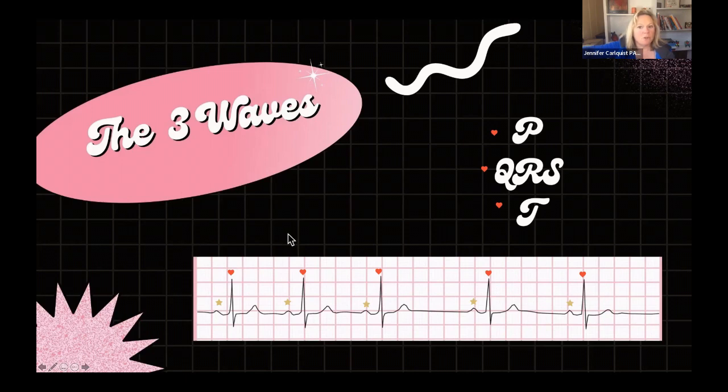So if we're troubleshooting this, then tell me if the rhythm is regular or irregular. Now, these little hearts kind of make it a little easier to see. Is it regular or irregular? The terminology means, does the R wave come at the next expected interval? So here's a little cheat sheet way I do it. Okay, everybody's saying irregular. Yes, you guys are right. Let's talk about that.